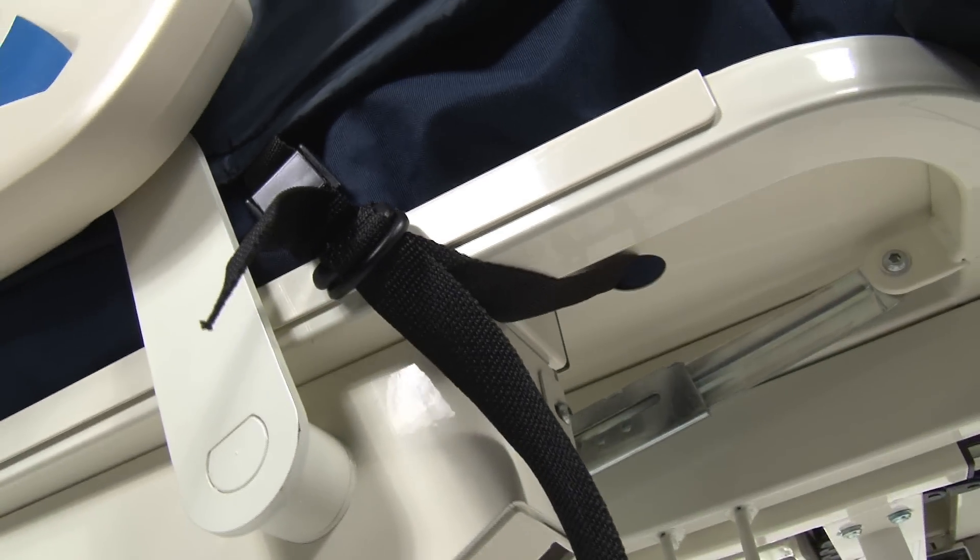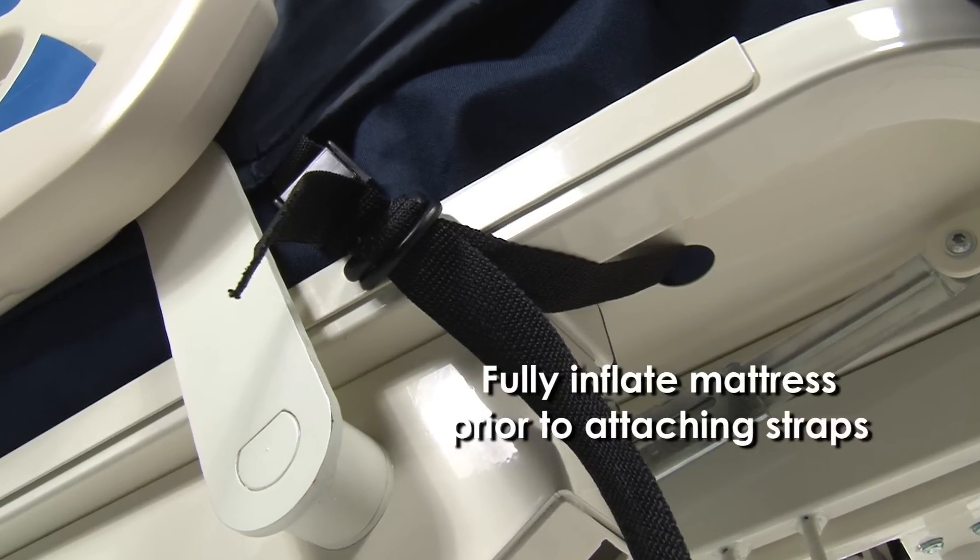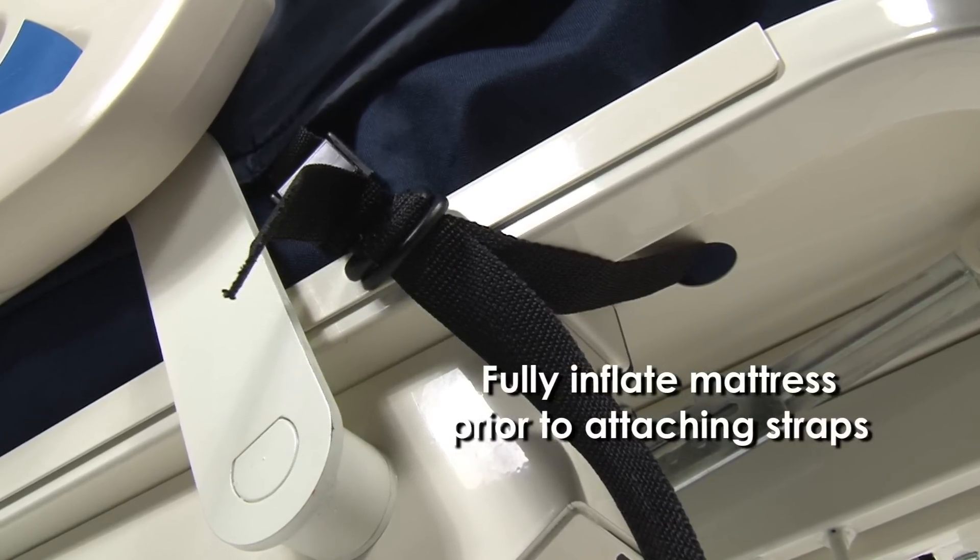The mattress includes safety straps to hold the Dolphin mattress securely to the bed frame. It is important to fully inflate the mattress prior to attaching the straps.